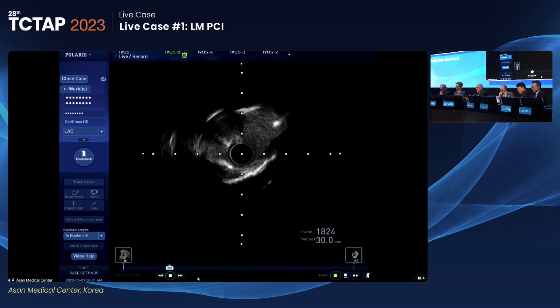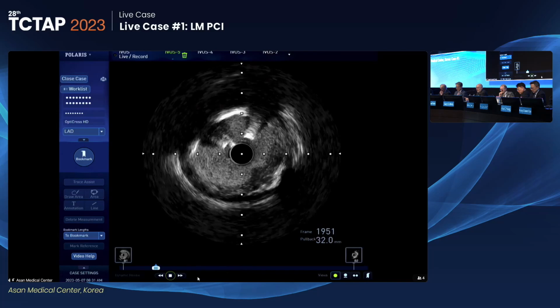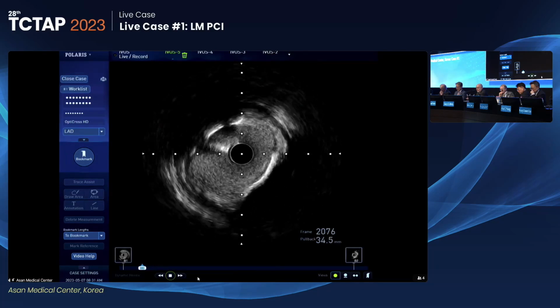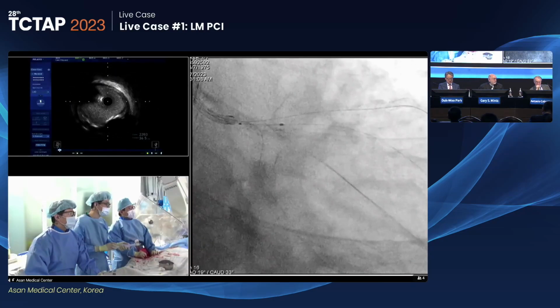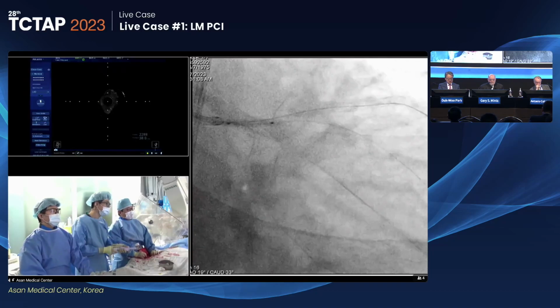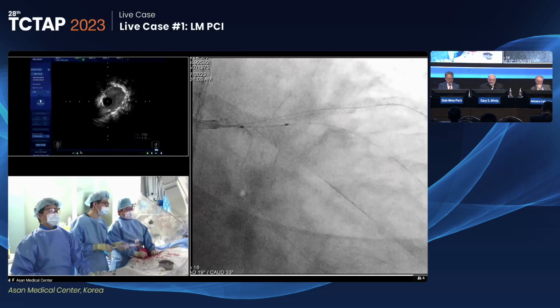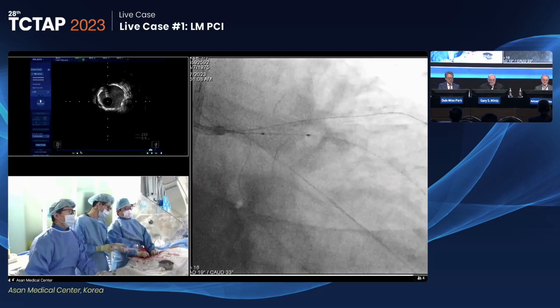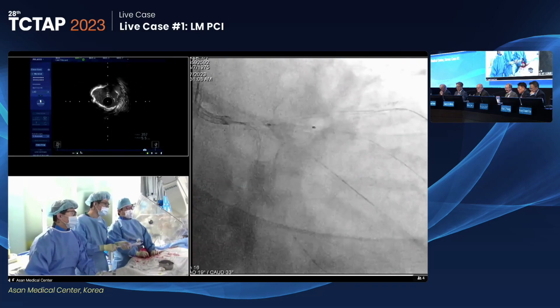Now we're into the distal left main, because you see the circumflex wire coming in at 1 o'clock, and it's a huge left main. It's 1, 2, 3, 4, 5, we'll get close to 6. Okay. 18. 20. Anyways, for the main interventions, we almost routinely use IVUS, imaging guided, to see where the calcium is.